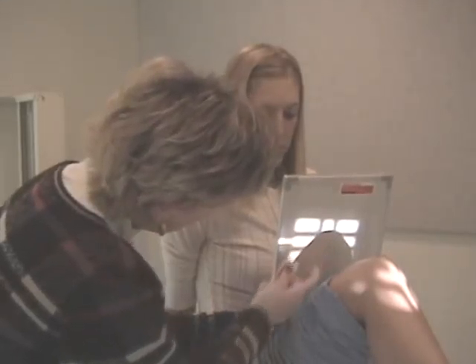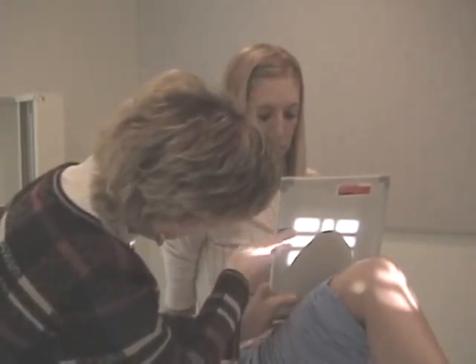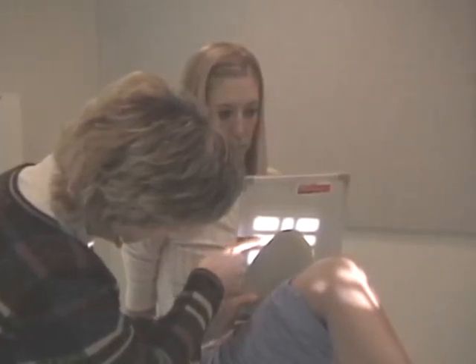And I'll move this marker for now, but I want you to look at the double crosshair here. This is where the central ray is coming. And we want it coming through the knee joint space. There's a dip here that you can use on many patients to indicate that you're coming right down through the patellofemoral joint space. Okay. And that's what you shoot for.